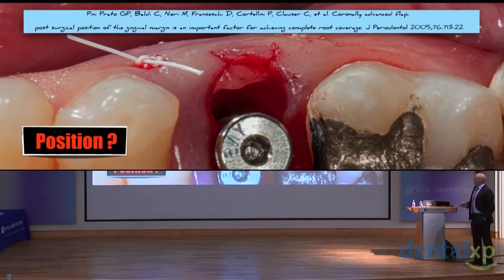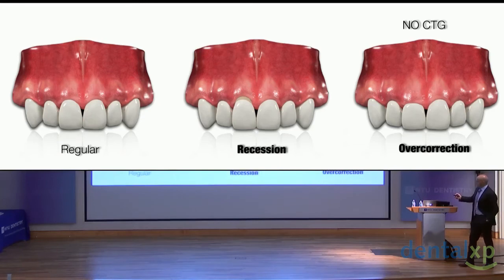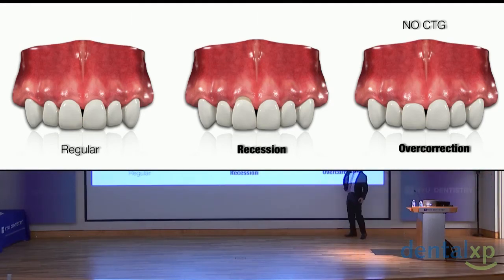With implants, we have to analyze the initial situation. I can have a regular situation, a recession, or an overcorrection. If I have this situation, I don't need any connective tissue graft because I already have more tissue than I need. I don't need any connective tissue graft.